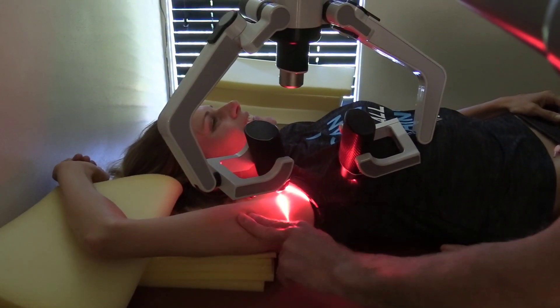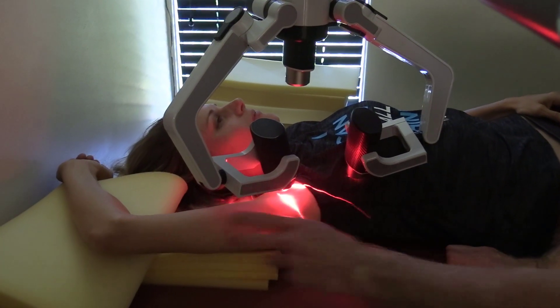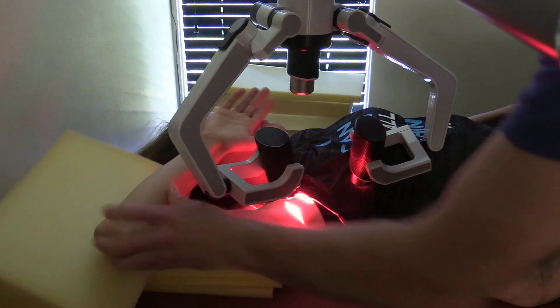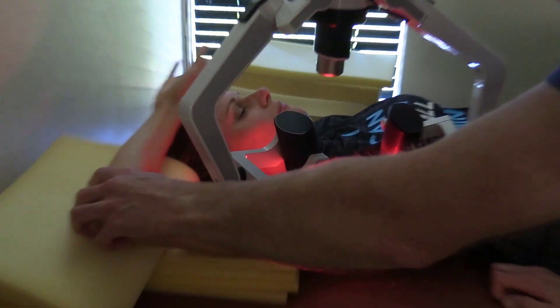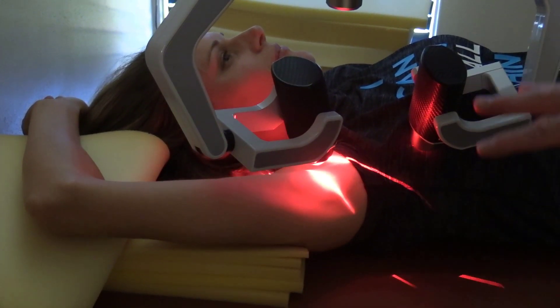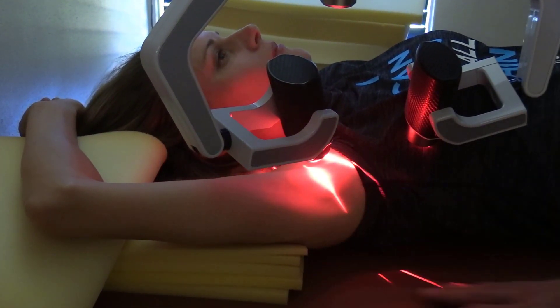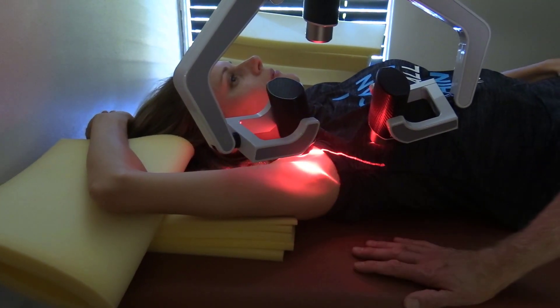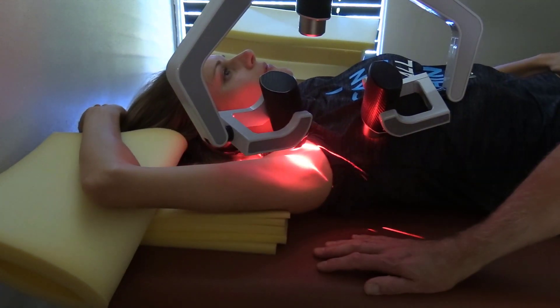This is also a good position to evaluate the tricep. If she wants to stretch that more, she can bring her hand down over her forehead and really feel the stretch there, but even the position she was in is just fine. Notice the pillow she has underneath her too. When you're treating these things, it's very uncomfortable to just be on a flat table. For some people it's fine, but a lot of people like a little height under their pillow, and for the shoulder to rest comfortably is just critical for this.